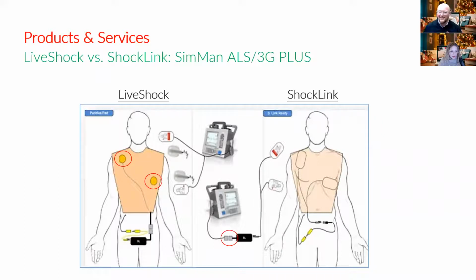That's a fabulous question. Yeah, there's honestly some really good ones. It's hard to pick. But SimMan 3G, as of right now, if we were to do a mega code scenario with him, there is really no ShockLink. There are a few products in our lineup that you can control with LEAP and integrate your defib through, I guess, what do we call them? Is it the same as the disc, the posts? Yeah, the posts, so it's a little bit different. When I go into the sim lab, I have some defib posts sitting on my bench, so I'd be happy to show you what the posts look like, and the difference. Absolutely.